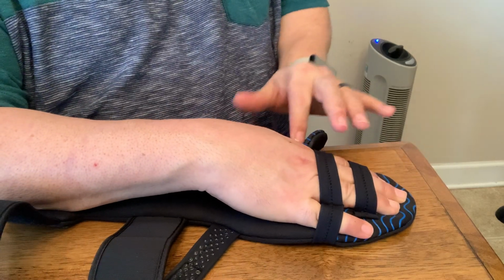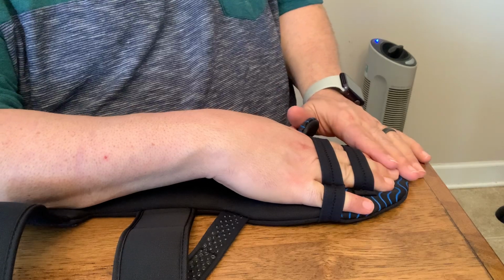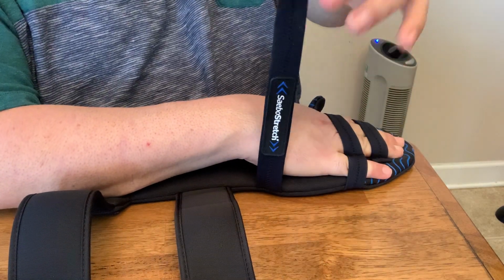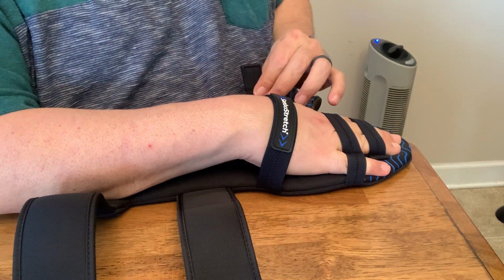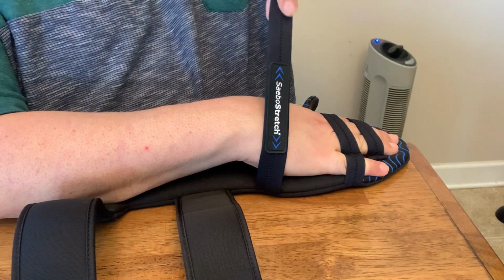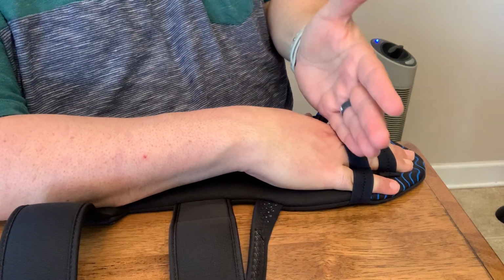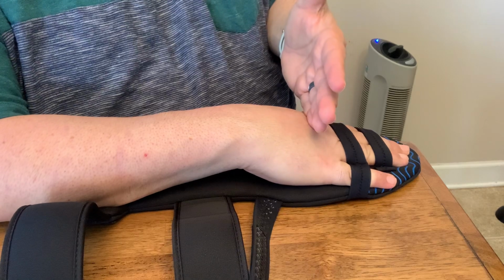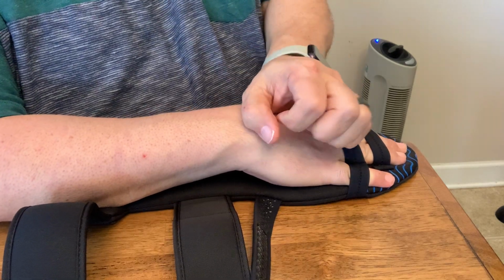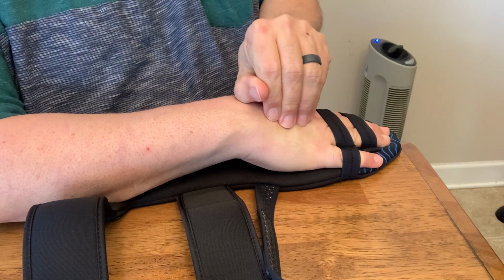Now, I've got my thumb in, my pinky in, and my three middle fingers in on my hand. Now I've got to do this one. This goes across the back of the hand, okay? And if you remember, the trick is, I used to strap it this way and it would work okay. But the problem is your hand wants to bend right here. These are where all your knuckles are, where your hand wants to bend. It wants to do this and start bringing your fingers in.